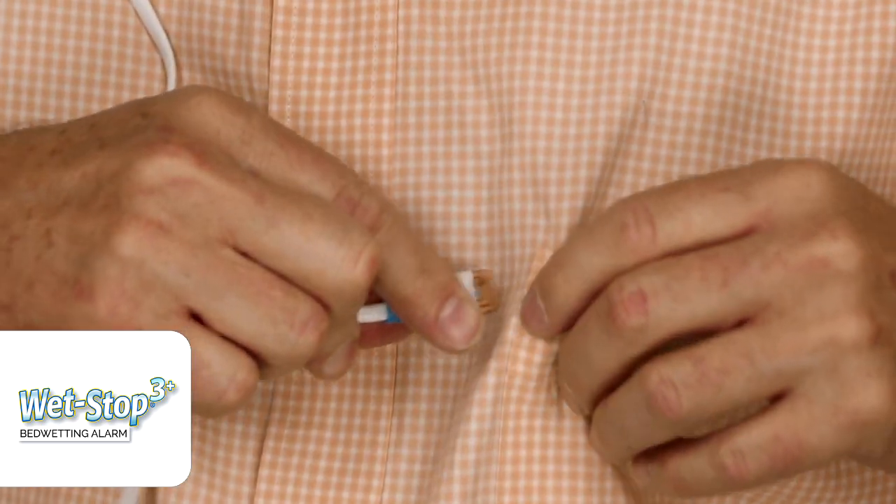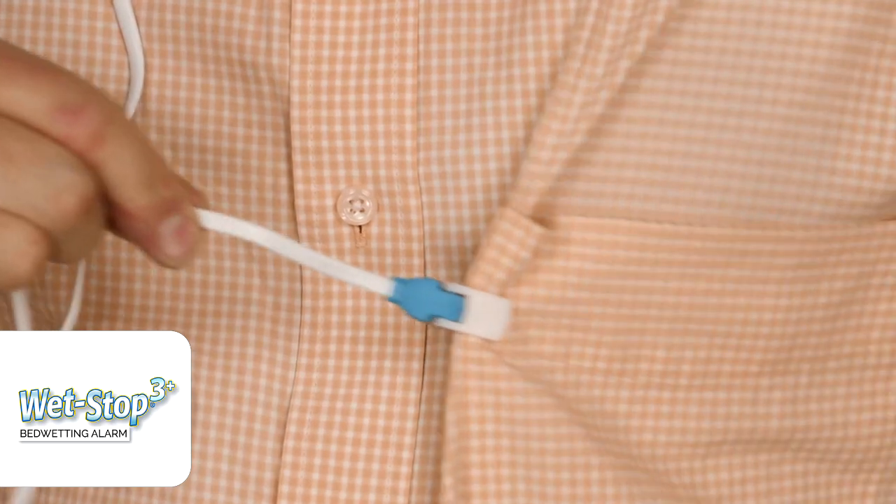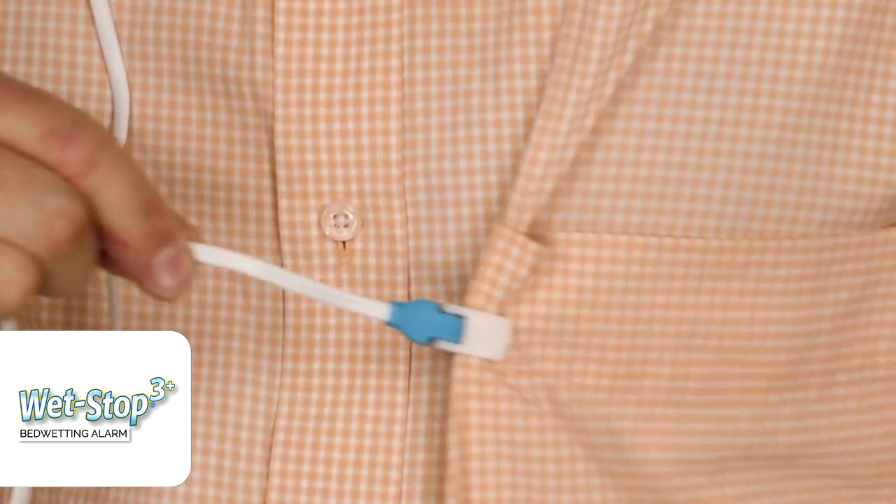You clip it down and it'll hold. I'll show you quickly on my shirt that if you clip this on there, it will hold. That's the initial setup. Let me remind you of a couple of things: first, make sure you put in your batteries correctly.